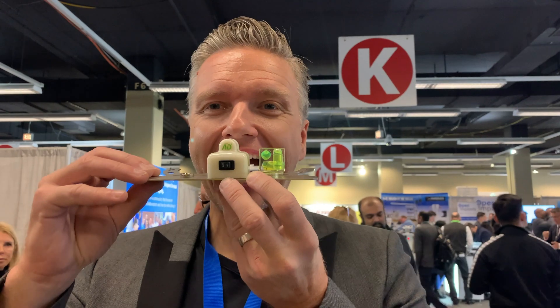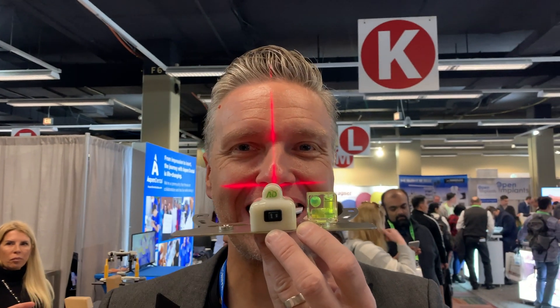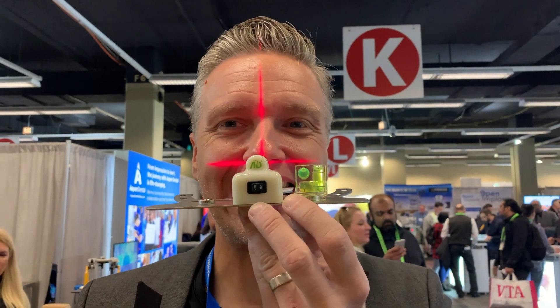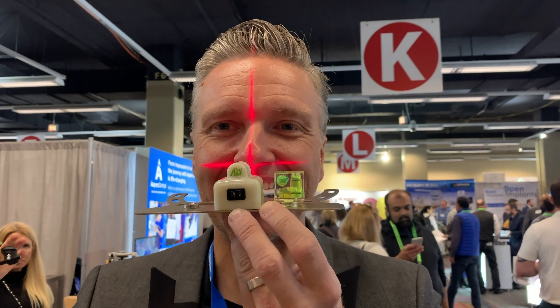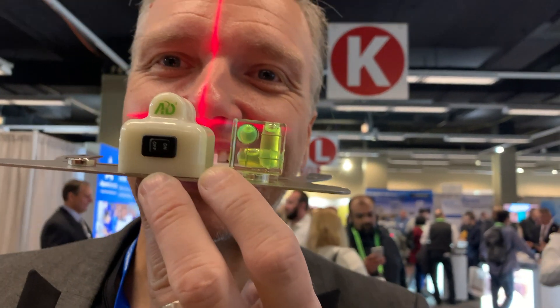On first look it looks like a Kois facial analyzer, but in reality it is the AD2 Easy Bow. It is not just a face bow — it has a laser which helps to orient the device to the face's orientation. As an additional feature, there is a level attached to the face bow which helps to define the horizontal.